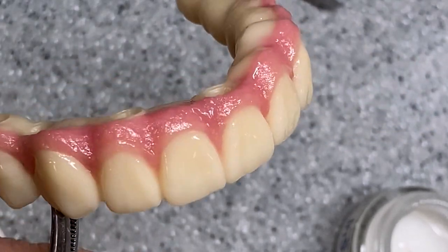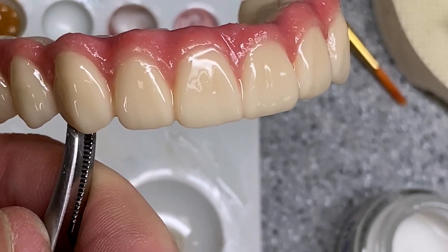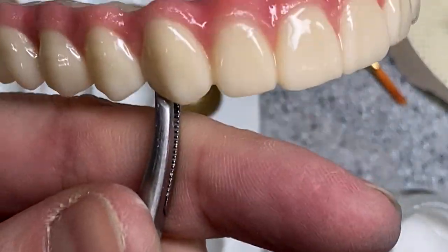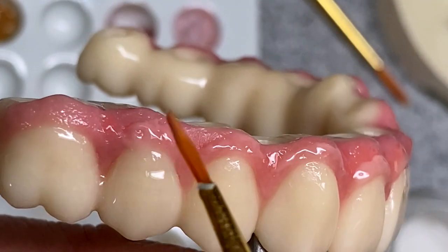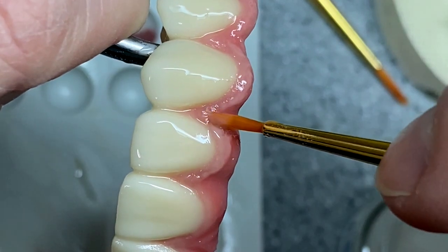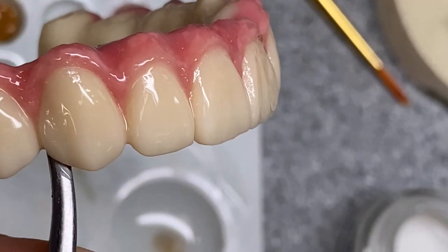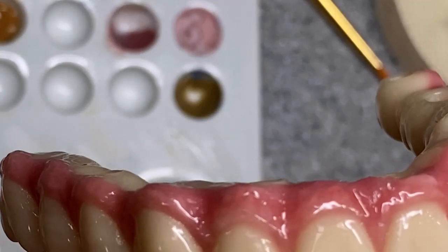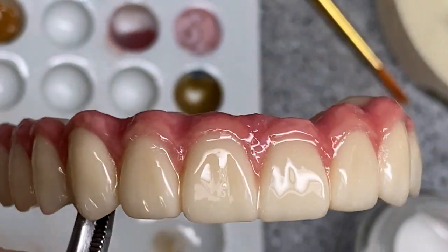So I covered it in glaze, and the tissue itself came out kind of dark. So I'm gonna take my salmon pink shade — it's this shade — and I'm gonna carefully apply it just around where the teeth are, and a little bit in the papillae. And then I'm gonna take some of my coral mameline and draw a bit of like yellowish stain on certain parts.